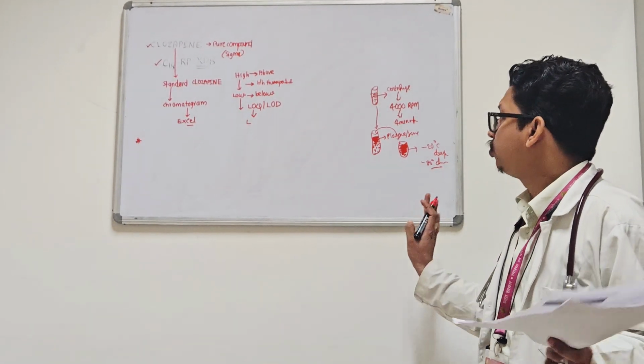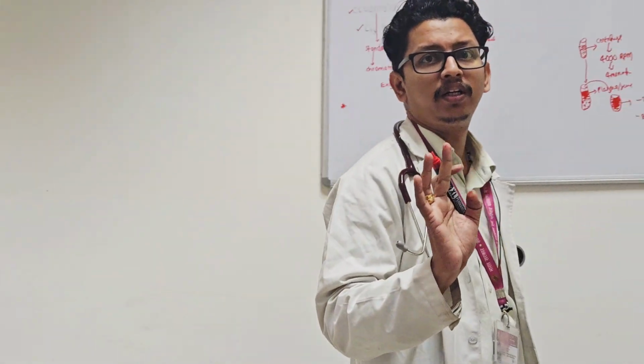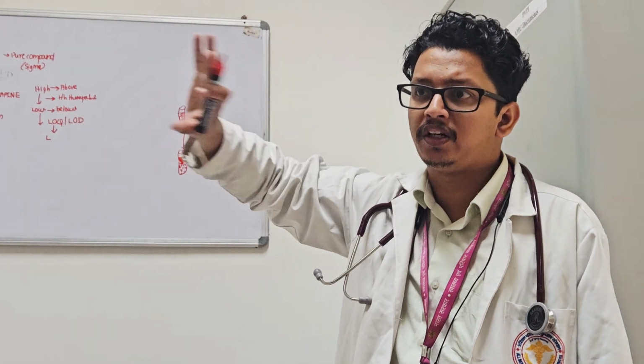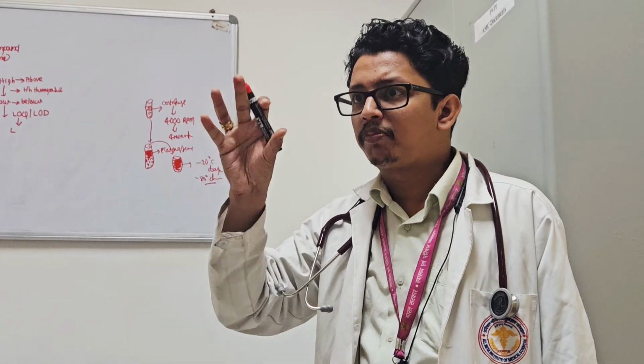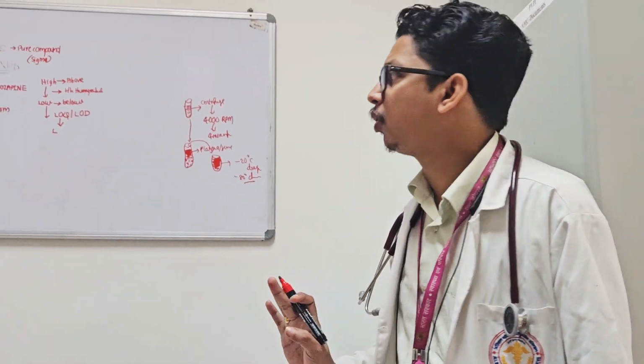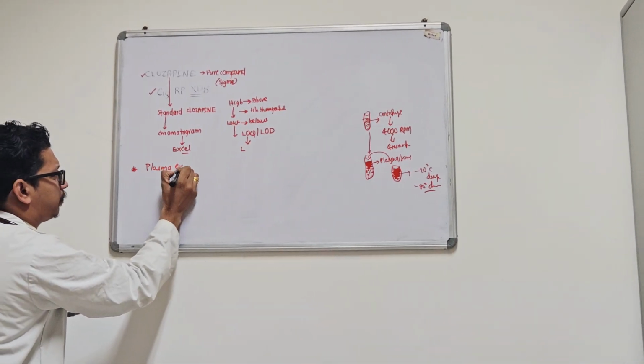Clear? Once you start the method, you are going to estimate from the plasma, so what components can occur inside the plasma? Plasma will have sugar, protein, albumin, globulin, and other compounds. So these things have to be extracted out of the plasma. Plasma should be cleared of high molecular weight compounds like proteins, mainly high kilodalton compounds, which should be extracted out from the plasma. That process is called plasma extraction.